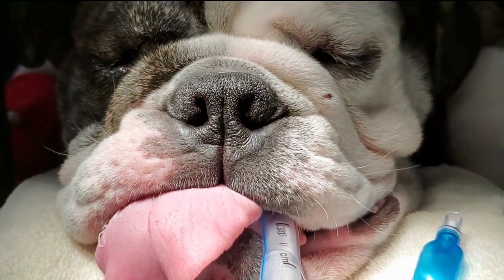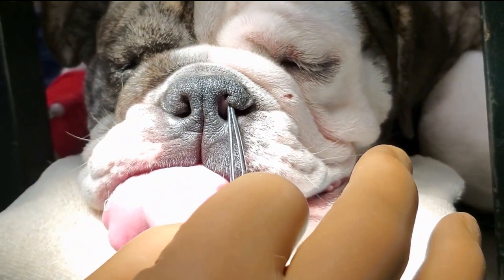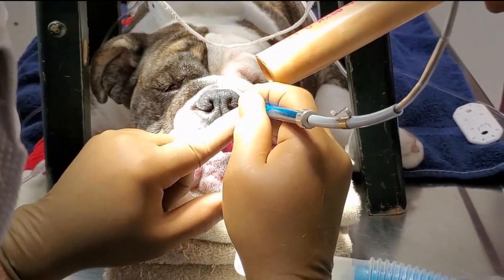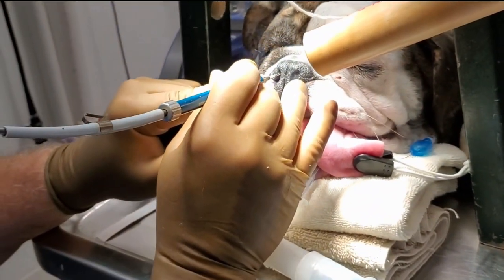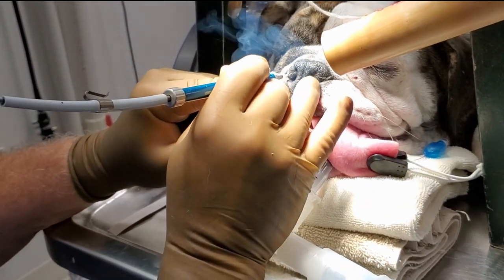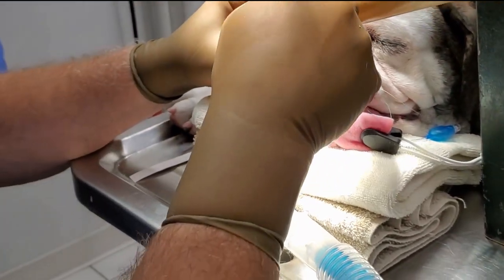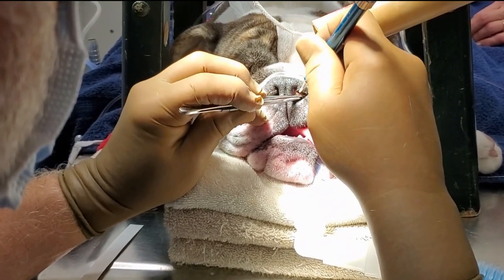So this is how it was done. You can see there's just a lot of redundant tissue sitting in that nasal passageway. Once you start recognizing it, it'll be hard to look at dogs that have that without thinking, 'Oh man, we could help that guy so much.' So here's the laser doing its job — we're trying to make it nice and even, going in there and lasering off those big hunks of tissue. There it is again, going right down through there and making the cut to remove that.